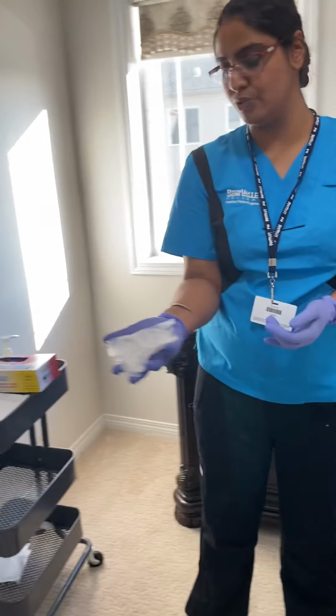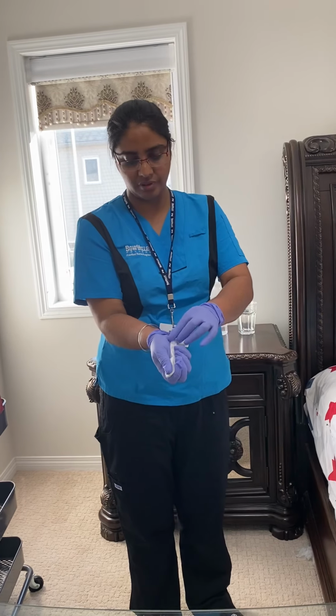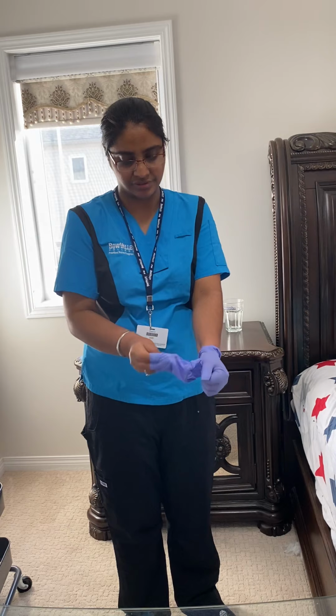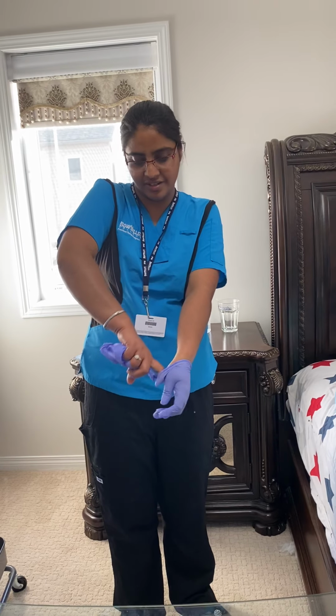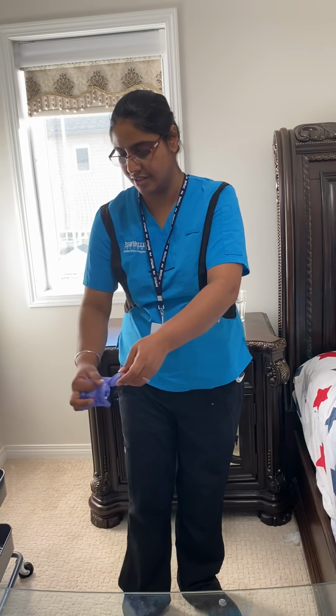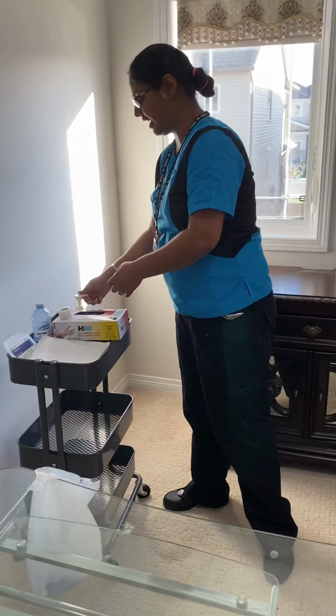So now I'm going to remove this dressing. I'm going to garbage this with my gloves. And the second one is from the inner side, and put it in the garbage. Again, hand hygiene for 30 seconds until dry.